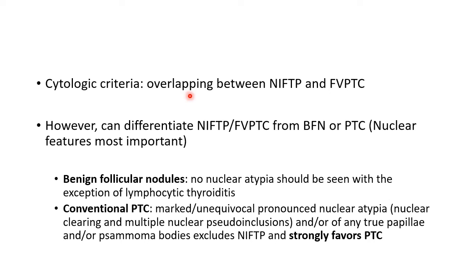The cytologic criteria are overlapping between NIFTP and FVPTC, and cytologically it is not possible to differentiate between the two entities. However, we can differentiate NIFTP or FVPTC from benign follicular nodule or papillary thyroid carcinoma based on the nuclear features.